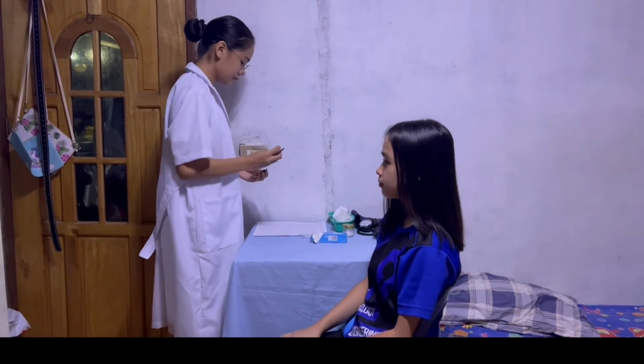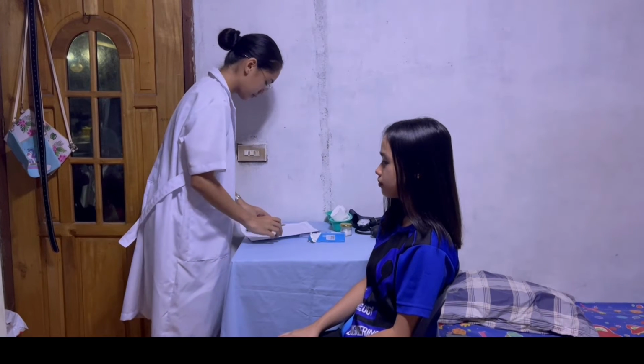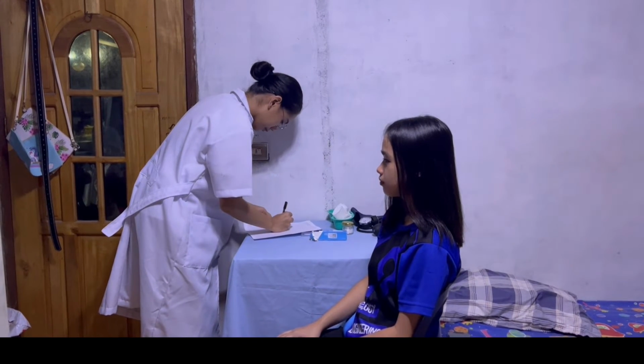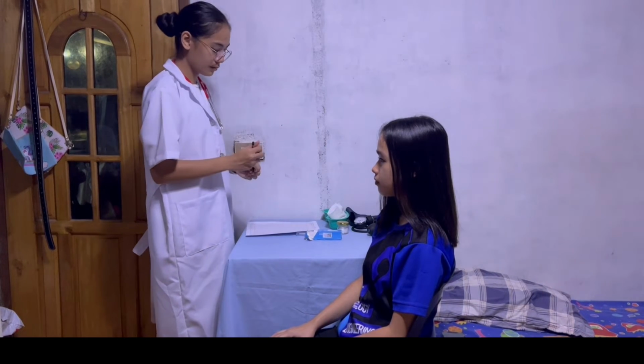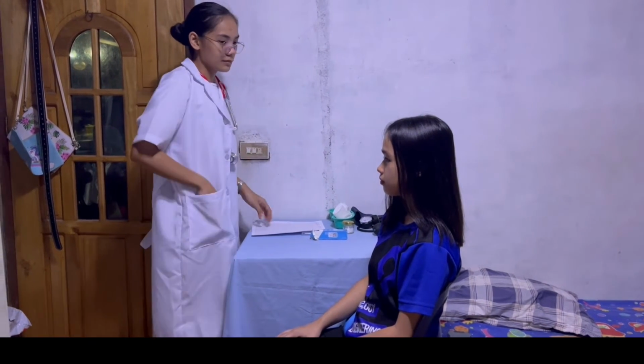Record the temperature on a TPR sheet as a basis for any nursing intervention. Write a nurse's note if there is a fever or any symptoms associated with fever per the patient's record.